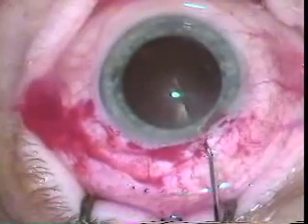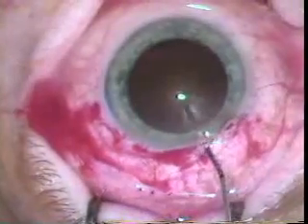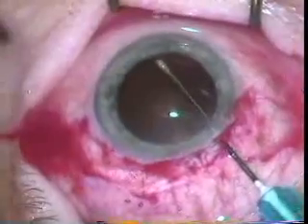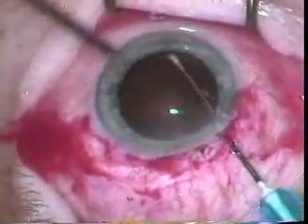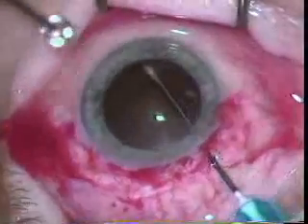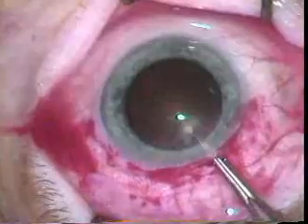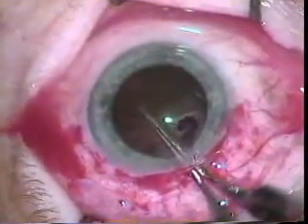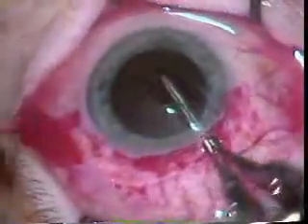Here you can see he's going all the way across with the cystotome — actually that was Healon — but here he's going across with the cystotome. You can see he's making the can opener move where you enter and then go over to where you entered before, and you do this around 360 degrees. Now with Kelman forceps he's grabbing the capsule and pulling it free with all the perforations that were made with the can opener.